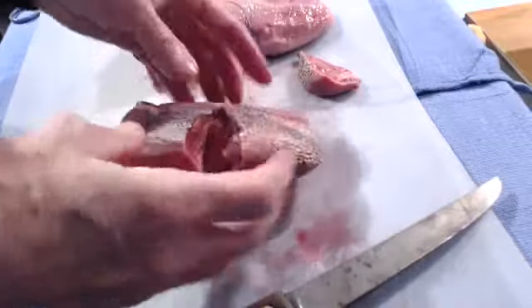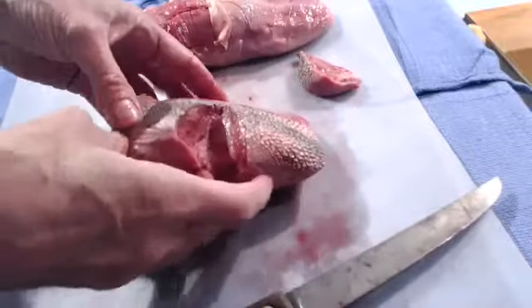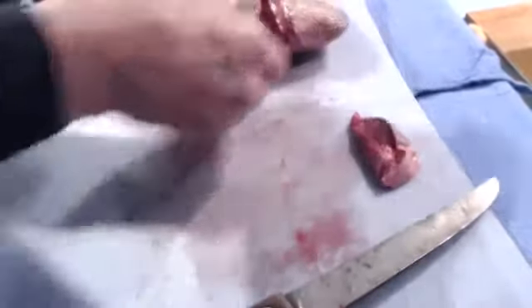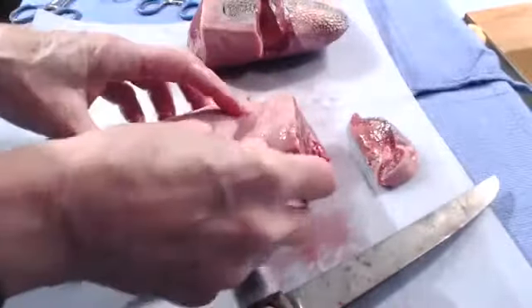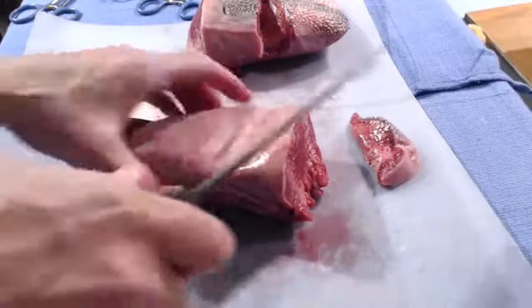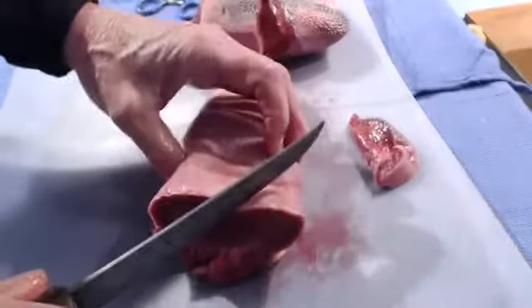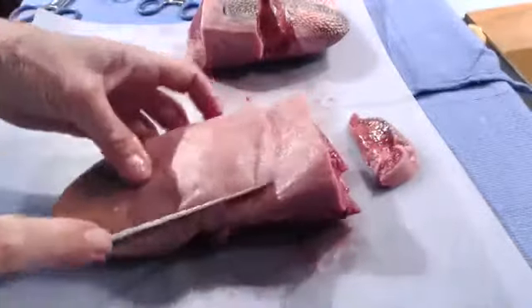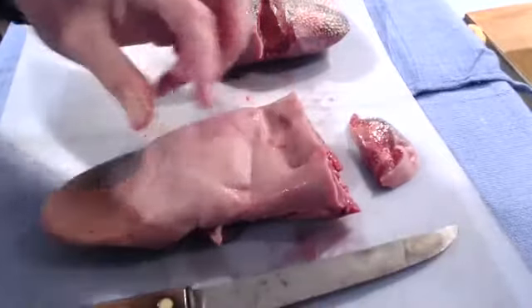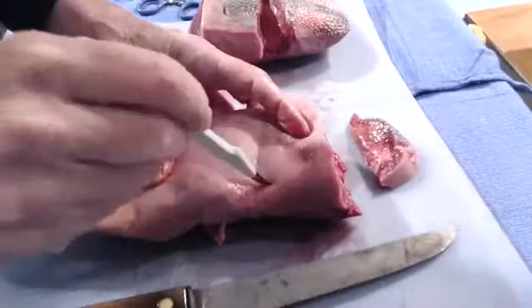Sometimes the beef tongues are big and you can make more than one tear on them. I am going to use this other section, and let me think for a second. I'd like to make a tear that represents a pocket. So sometimes you get, I'm going to do it this way, that knife is not going to be sharp enough. We'll go for a scalpel here.